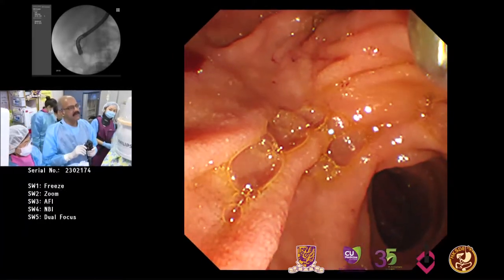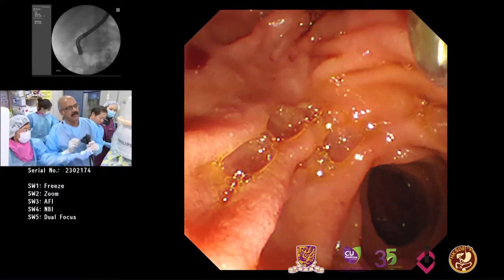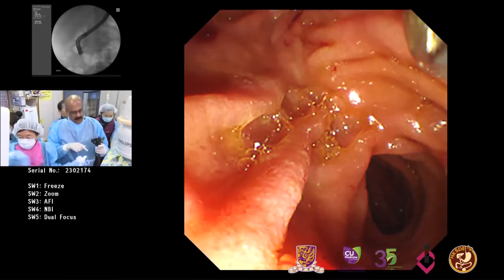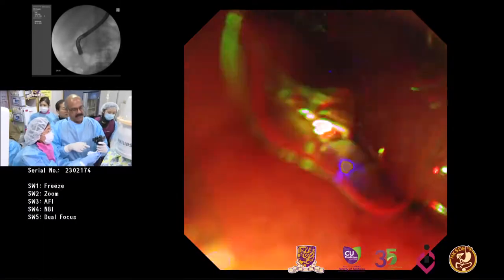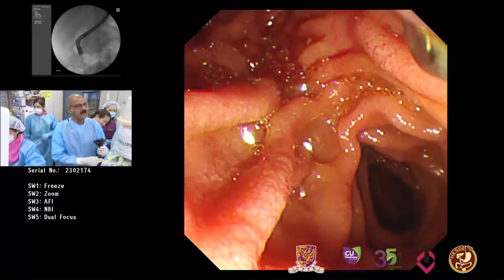And once we got in, we stabilized the scope, and the reason we had to do that is that initially we had to go very left and then turn right, a little different from what you normally do. You'll also notice that my scope has a tendency to slip out into the stomach, so I'm trying to keep it more towards the right side to avoid that.